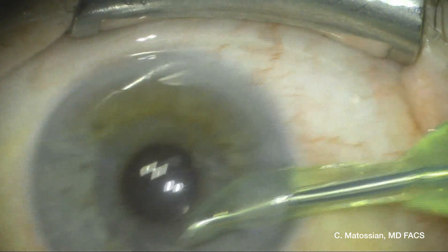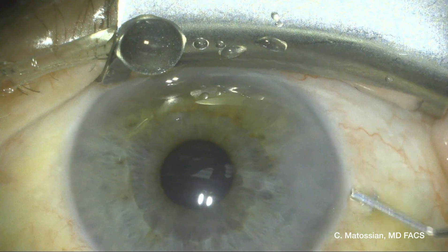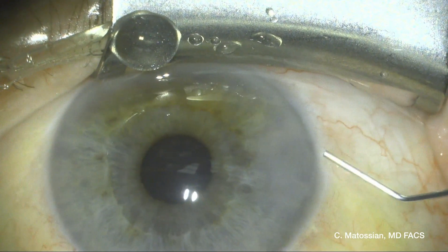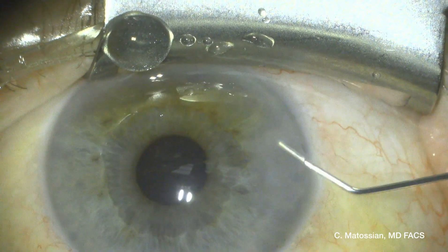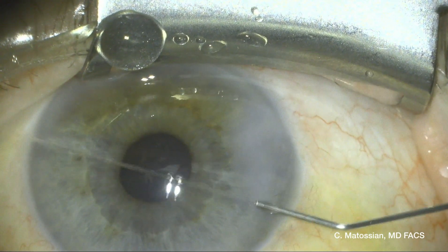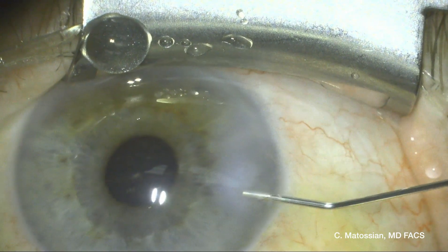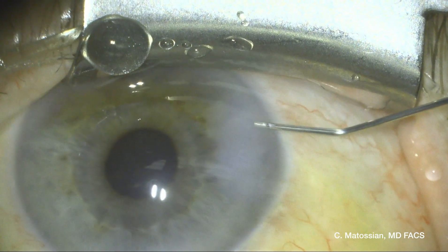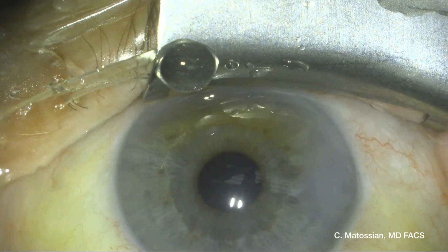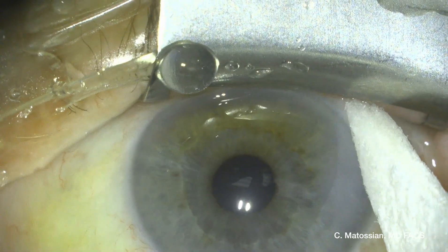Once I was assured that everything was clear and clean, I am now sealing my incision using a 30-gauge cannula. Since I re-manipulated my original corneal incision, I wanted to place the Reshore sealant over the incision to make sure that the incision stayed as watertight as possible. I'm drying the area with a wax cell sponge.